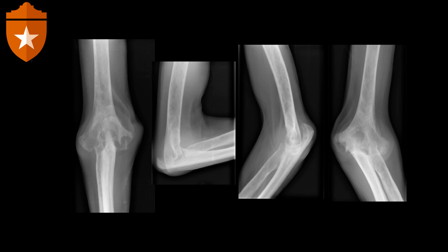Another example: we have bilateral elbow radiographs, and on both elbows we see chronic destruction of the bone around the elbow articulation, including the distal humerus, proximal ulna, and proximal radius. There is also subluxation. This is an articular process because it is centered within the articulation and affects both sides of the bone, including the subchondral plate. It is a chronic and systemic process because it is bilateral with well-defined erosions.